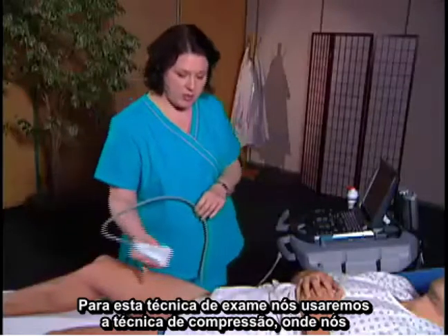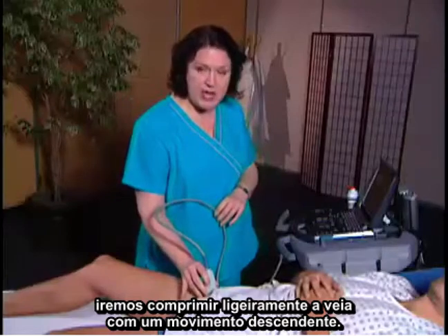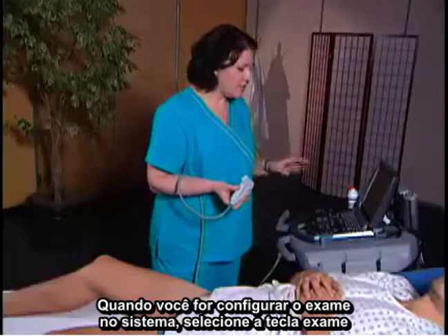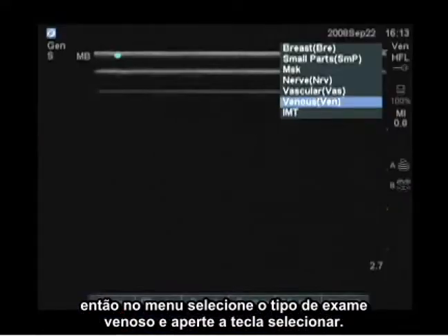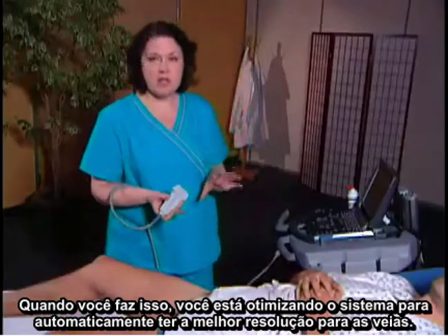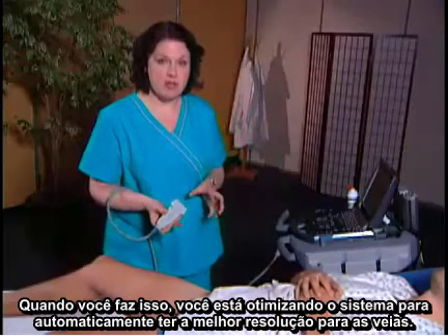For this examination technique, we're going to use a compression technique where we just slightly compress the vein with some downward motion. When you set up the exam on the system, select the exam key, then from your menu select the venous exam type and hit select. This optimizes the system so it's automatically configured for best resolution of the veins.